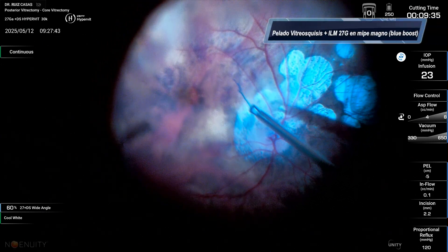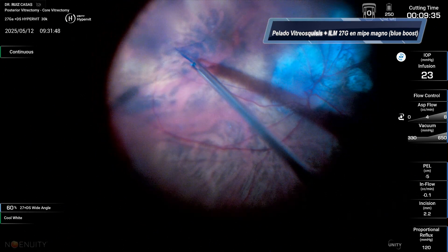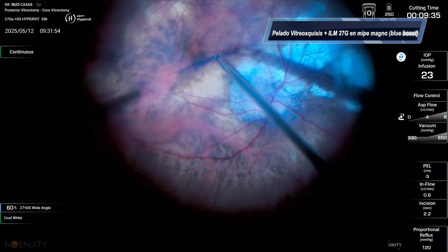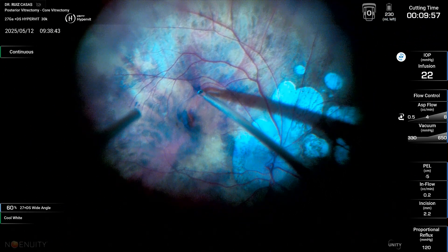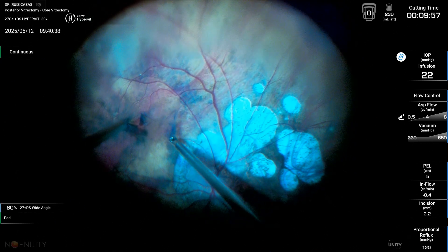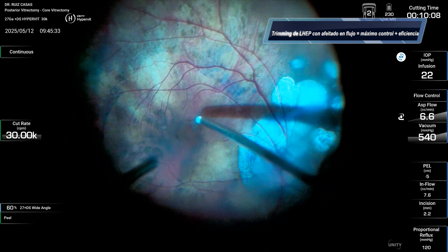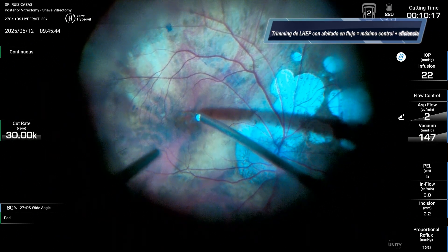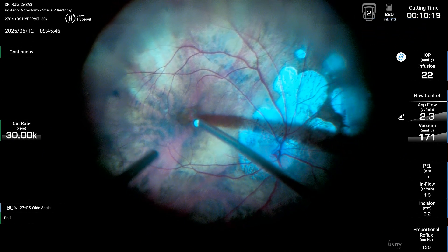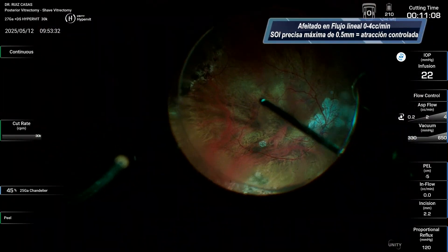In this case, despite the patient being quite myopic, it was a lamellar macular hole. I could remove the vitreoschisis and the pre-retinal membrane and ILM with the 27G forceps, because this shaft and these micro cannulas allow you to introduce the instruments further into the eye.